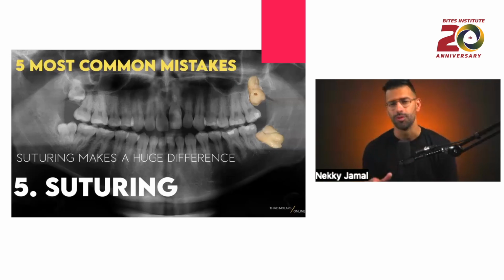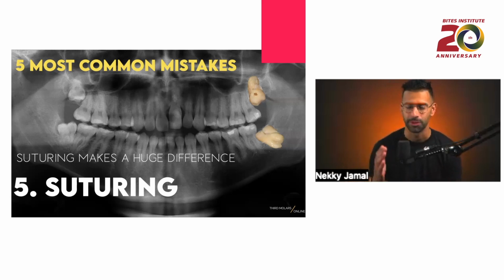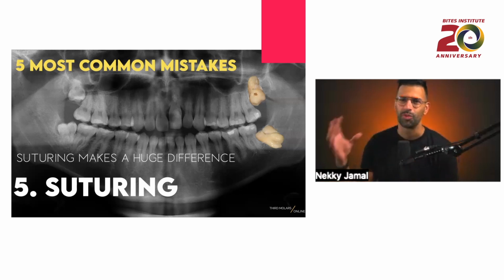And if I can give you a tip, make your incisions with intention and with confidence. Make sure your blade goes all the way to the bone. Make sure you're using a sharp blade. Switch your blades after every third molar you take out so you can get those crisp, clean lines, because when you have clean lines, you can put it all back together. If you're constantly sawing at the tissue, you're just tearing the periosteum, and the patient's going to swell out to here.